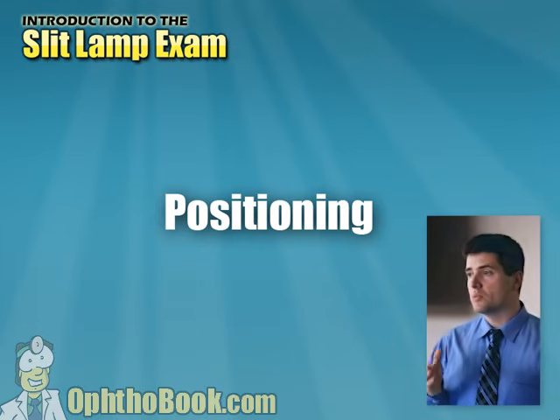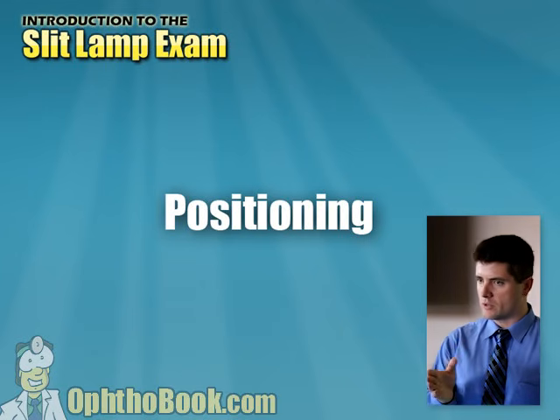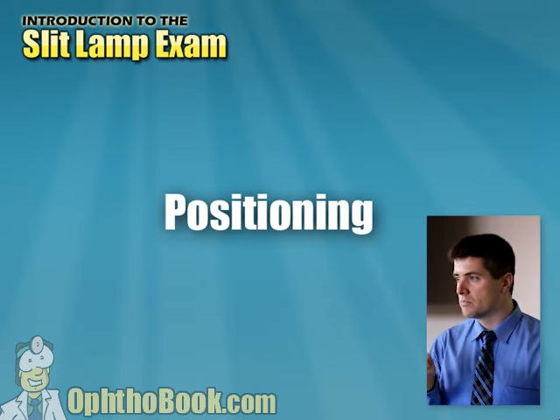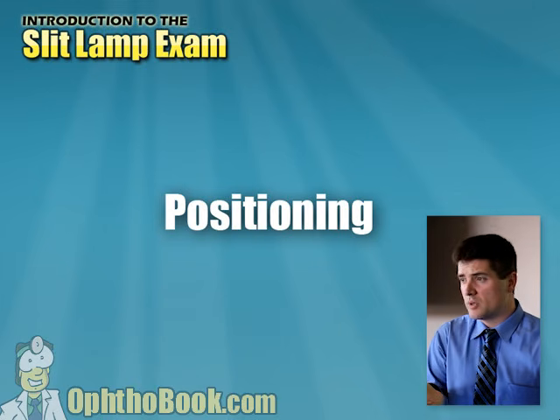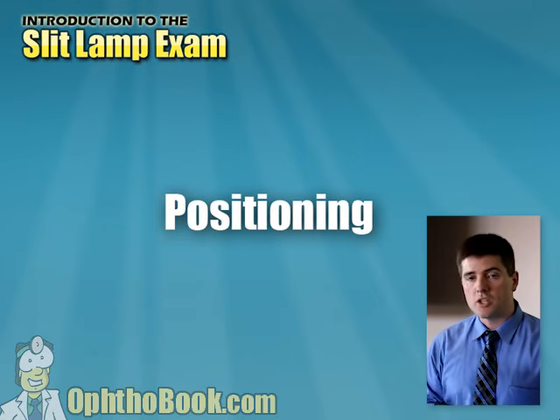Positioning. Now, we've been trained from a customer service standpoint to always put your patient first as far as comfort. But when it comes to the slit lamp exam, your comfort is actually more important, I think. If you think about it, a patient is an exam once or twice a year. You're doing this 3,000 or 4,000 times a year. And talk about repetitive stress injury. So when you start with positioning, make yourself comfortable before you make your patient comfortable.